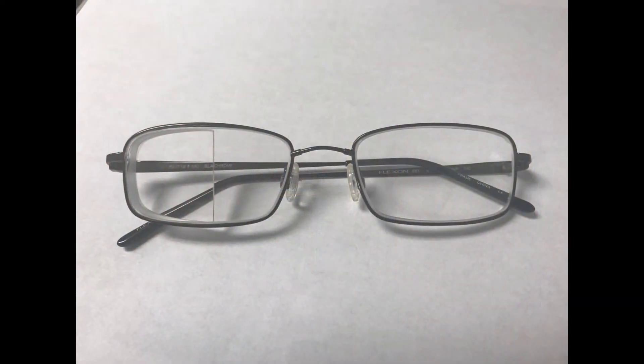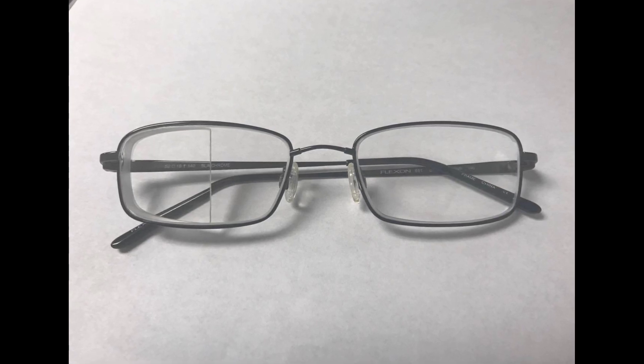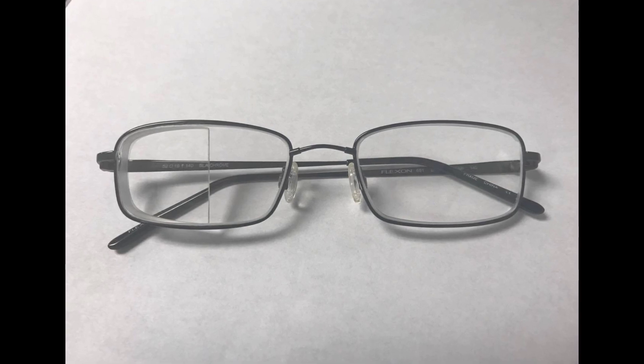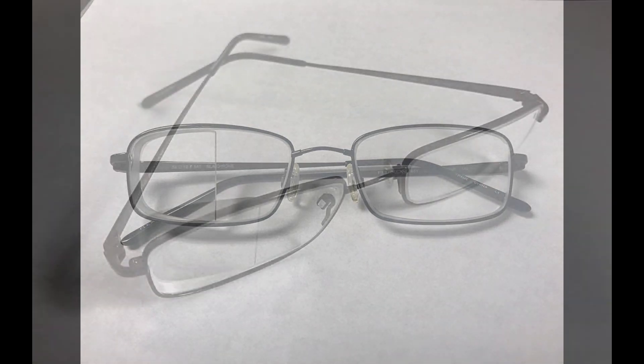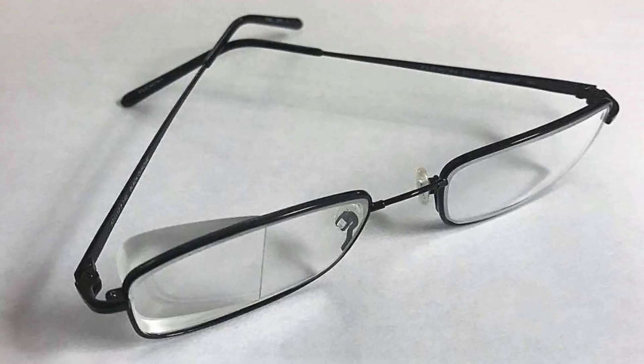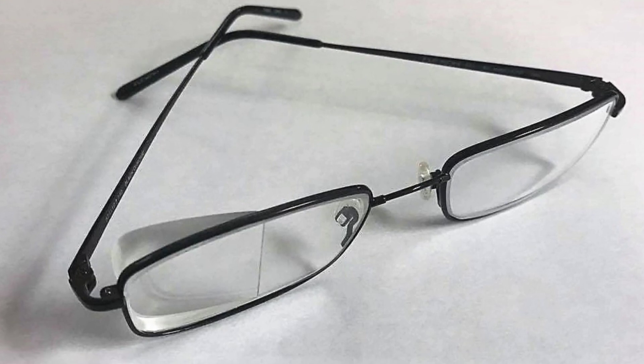Hi, this is Dr. Long with Midwest Low Vision. I wanted to share some recent success stories involving some special glasses that I prescribe — they can help people who have had strokes or other brain injuries and lost half or a portion of their peripheral vision to one side. What you see here is an example of the side vision awareness glasses, and you'll notice a line through the center of the right lens.